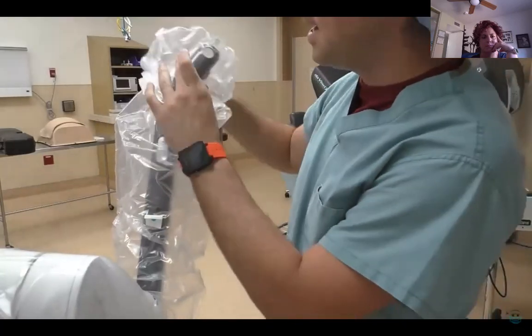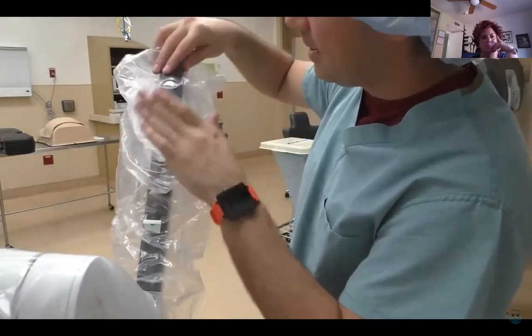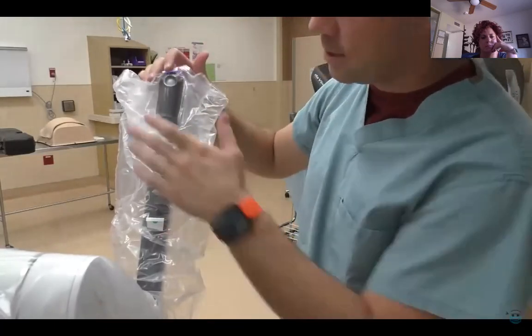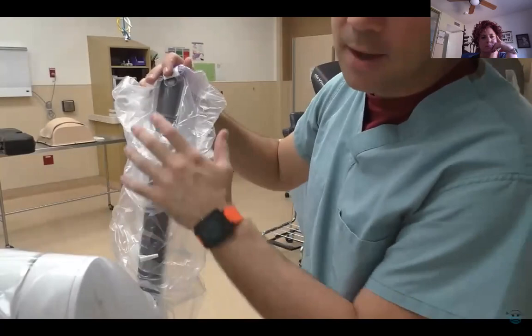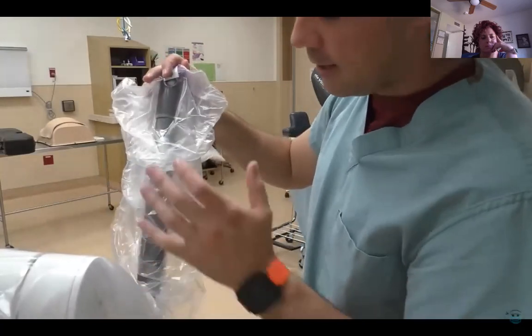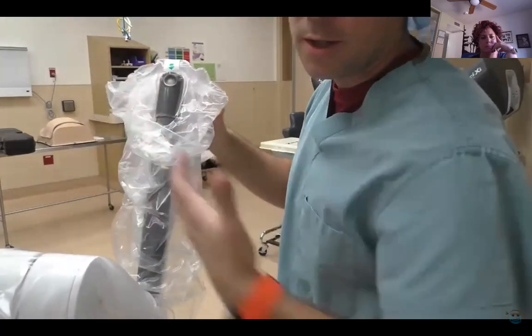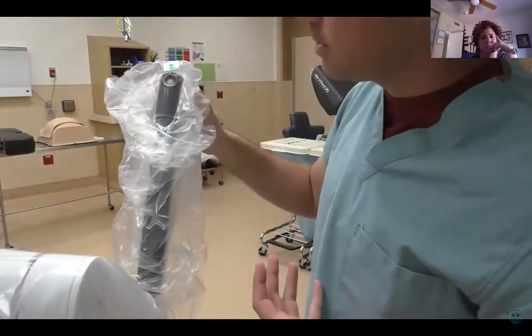It's just going to slide and clamp in. Remember, try to keep the plastic out of the way. And it's just going to clamp in place to try and keep some of that slack out of the drape itself and keep it down instead of bunched up over where you're going to be inserting instruments.